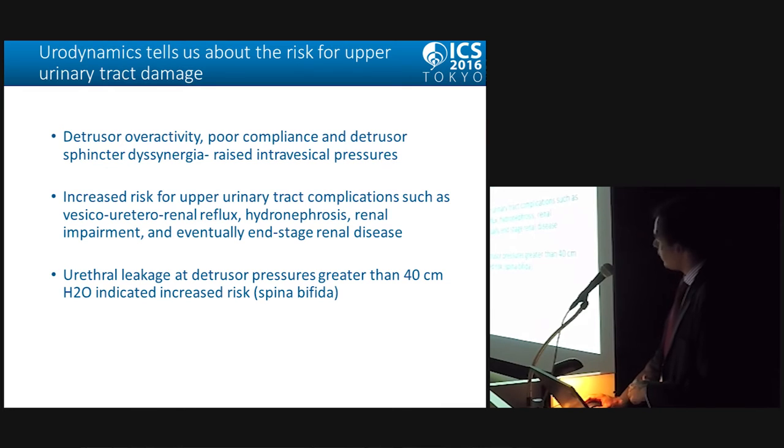Now, it also will tell you about additional urological pathologies. So we heard about the importance of examining the prostate. The common scenario is a middle-aged man with Parkinson's disease, where there is a degree of lower urinary tract symptoms and a degree of obstruction. Video urodynamics would be a useful tool to establish whether there is indeed outflow obstruction as a result of an obstruction at the level of the prostate gland.